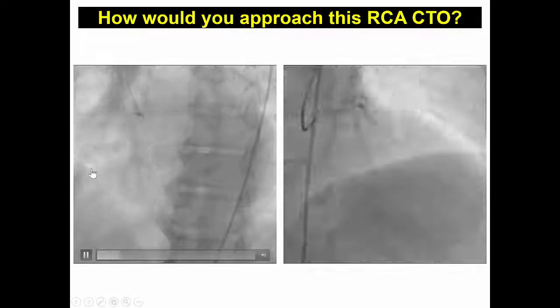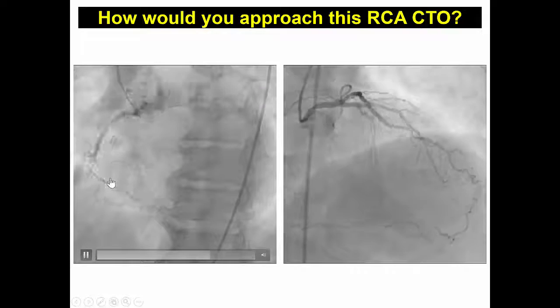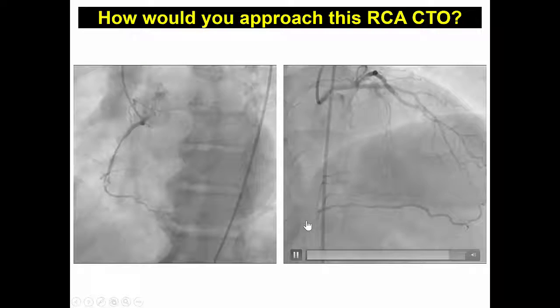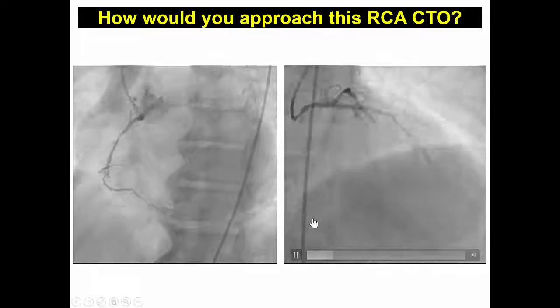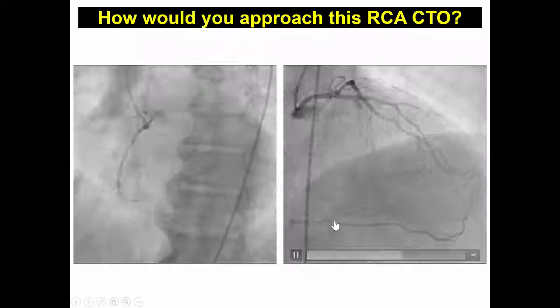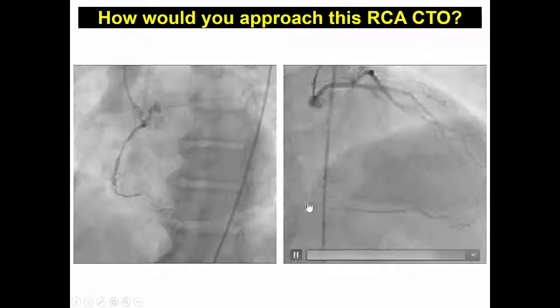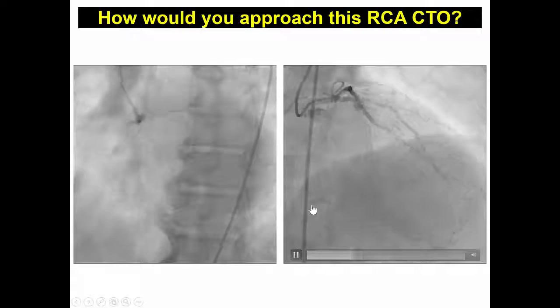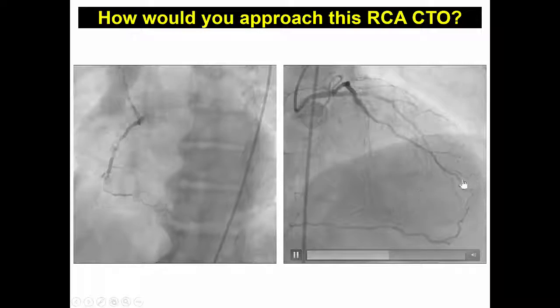Regarding the CTO, there is a very well-defined proximal cap and it appears to be a long occlusion with reconstitution of the right coronary at the crux of the PDA and PLV.